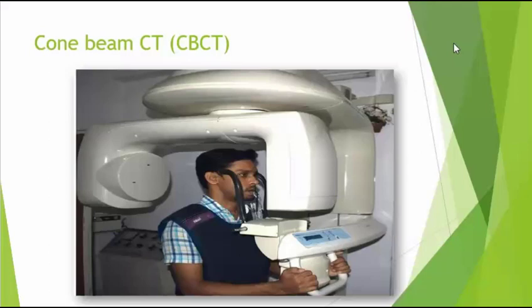Cone beam CT, or CBCT. It is one of the latest revolutionary cutting-edge technologies in dental and maxillofacial imaging. It enables quick, fast, easy visualization of the patient's craniofacial structures with unparalleled 3D precision. It provides undistorted dimensional images of the jaws in cross-section, axial, coronal, sagittal, panoramic, and 3D images.